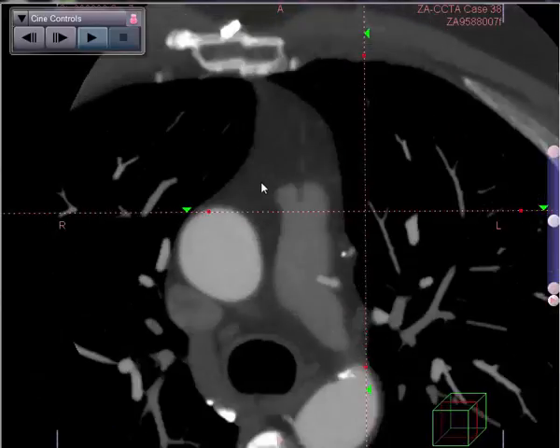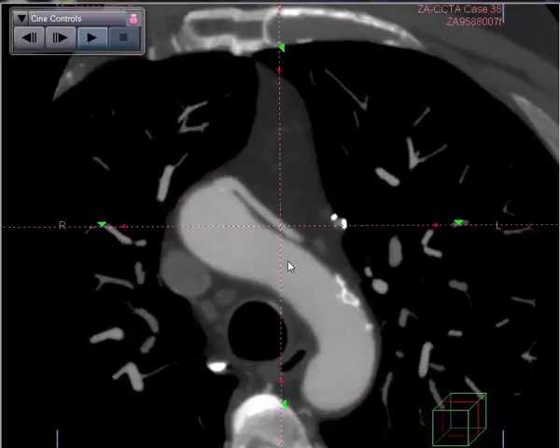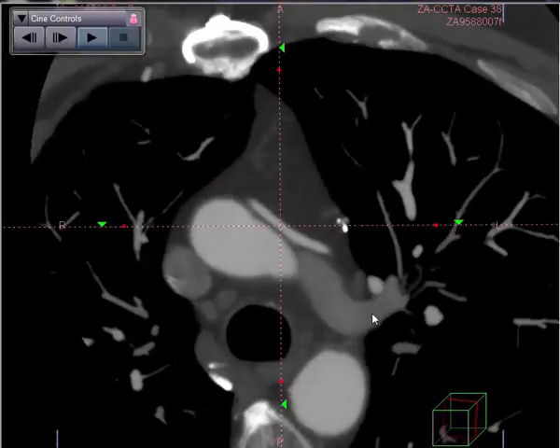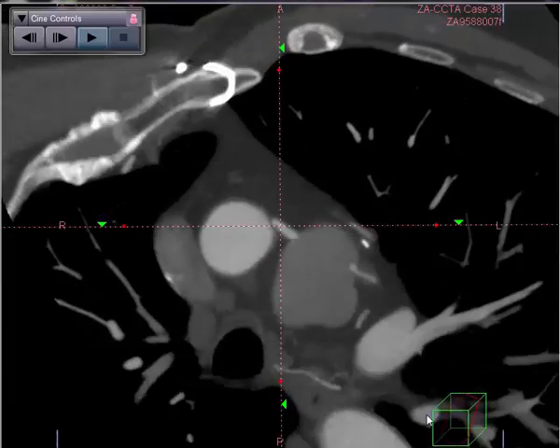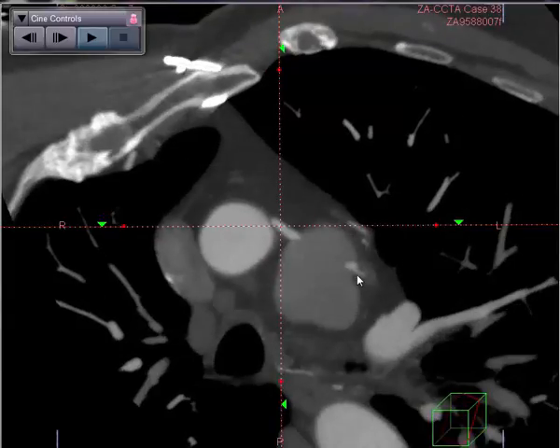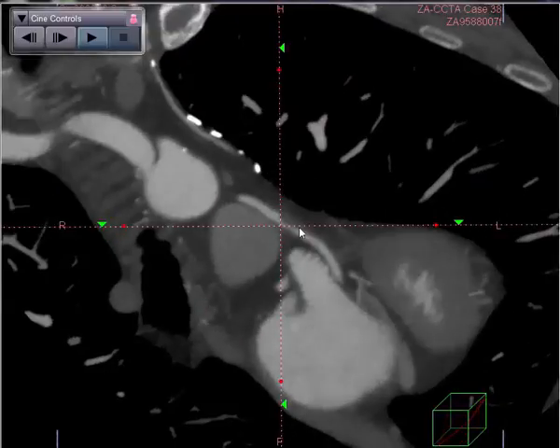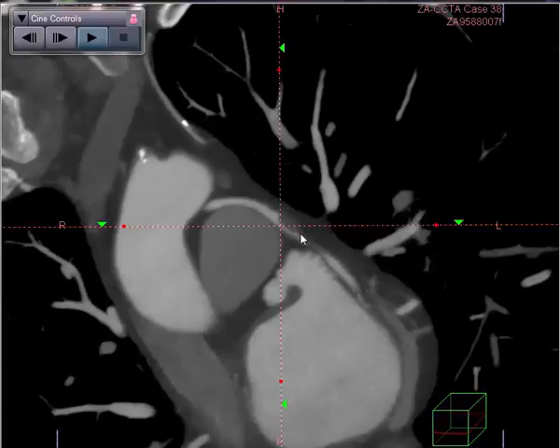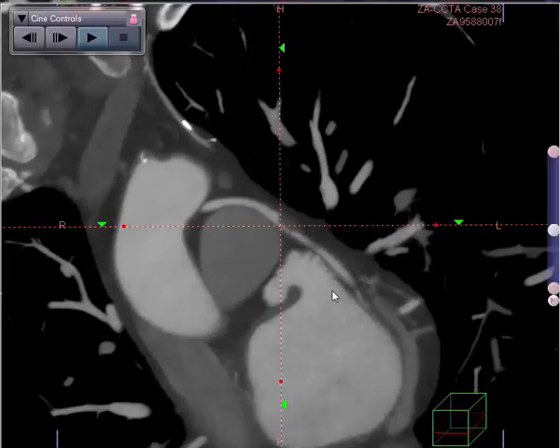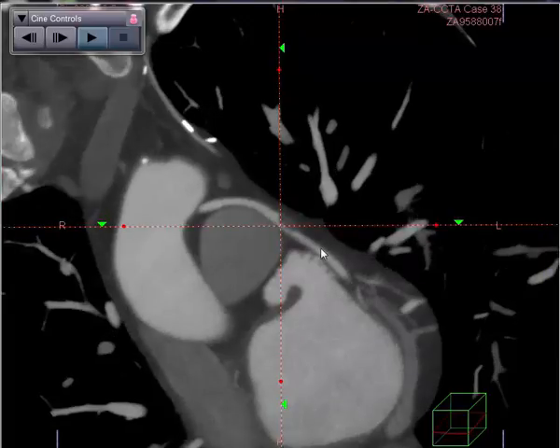Let's take a look now at the saphenous vein graft to the obtuse marginal. This appears to be a very good-looking graft. As we proceed down distally, however, we notice that there is a possible area of narrowing. You can see that there is an area of non-calcified plaque, possibly thrombus, that appears to be distinctly and focally narrowing this bypass graft.